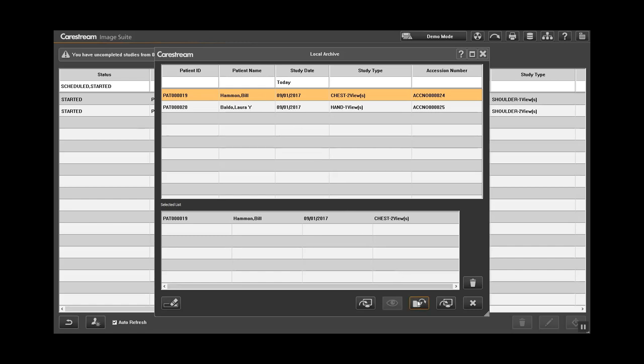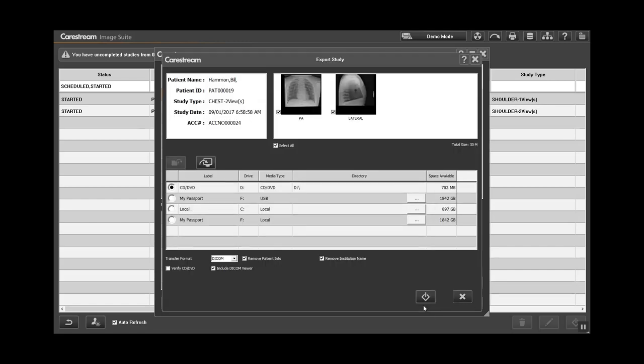Select the Export button in the lower right corner that looks like a folder. Select the CD radio button. The study to be saved will be automatically checked.